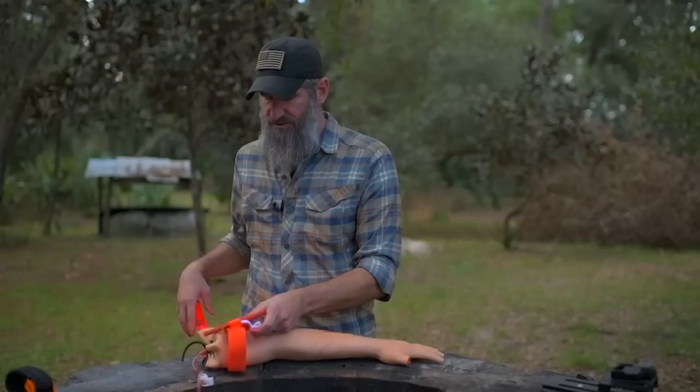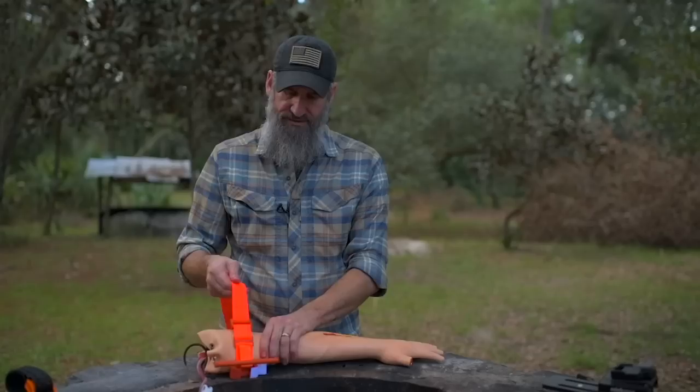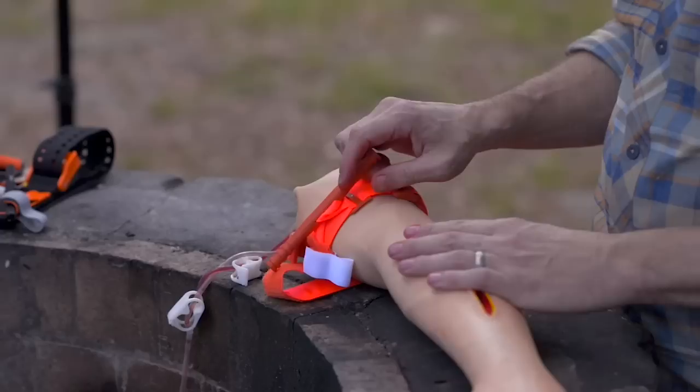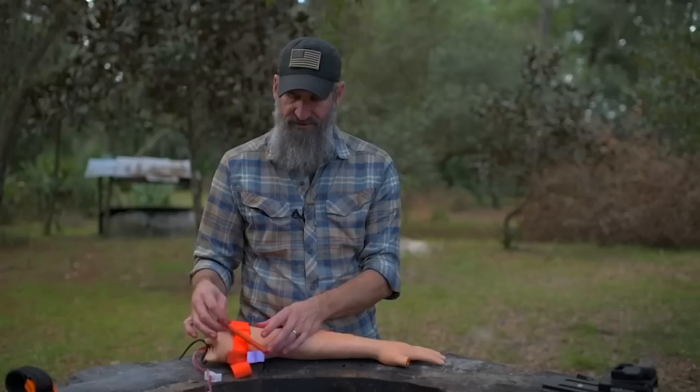Once you get it in place, you want to get it as tight as possible before you secure it down. You want to take all that slack out before you start using the windlass to make it tighter, because you are trying to compress tissue and push that artery against the bone — or in some cases a vein — with that pressure.